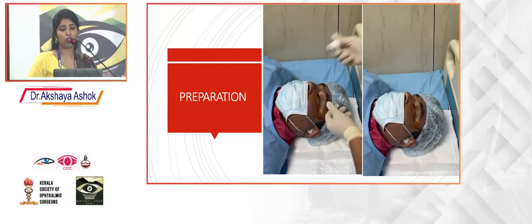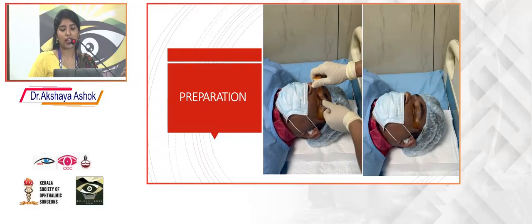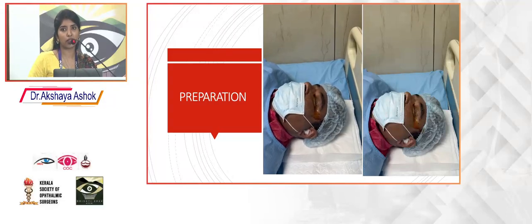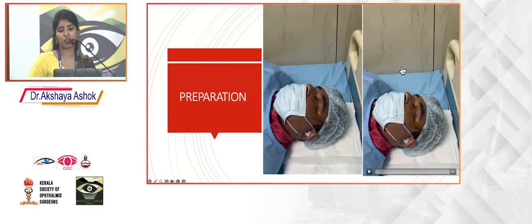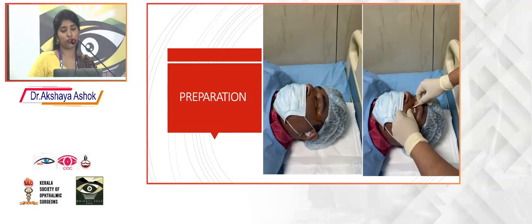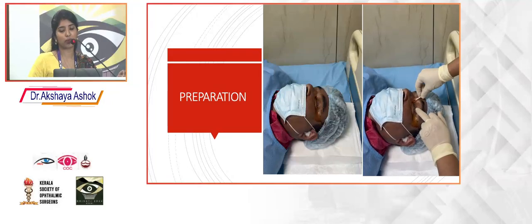Now, preparation of the eye. Instillation of 5% povidone iodine in the conjunctival sac is an accepted universal practice, and it has been strongly recommended for the prevention of endophthalmitis following injection. In our setup, after instilling povidone iodine, we also give a nice lid scrub with a cotton bud soaked in 5% povidone iodine. Both the upper and lower eyelids are scrubbed nicely.